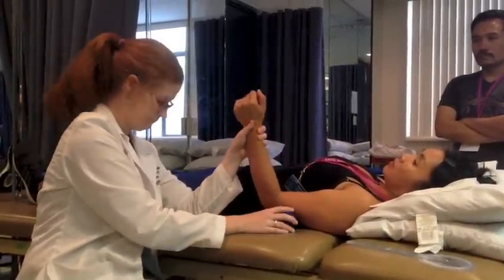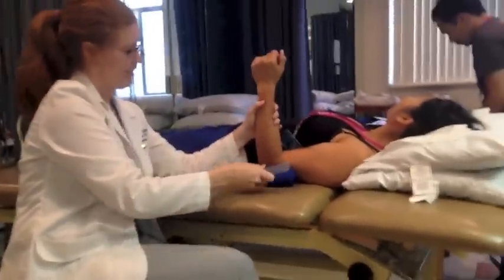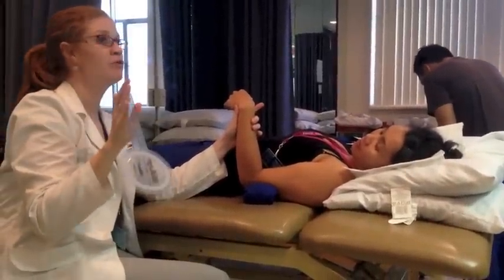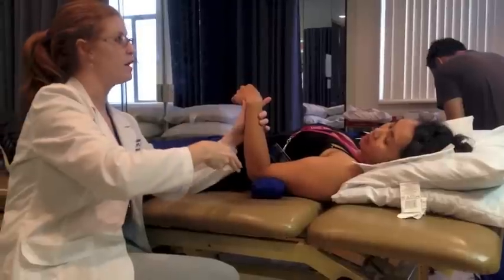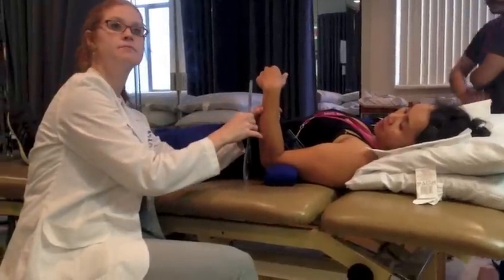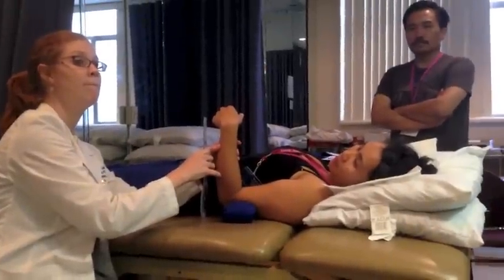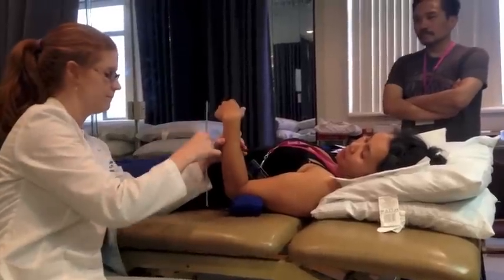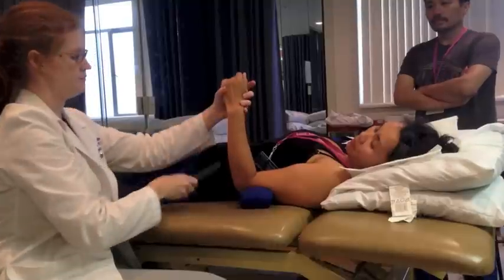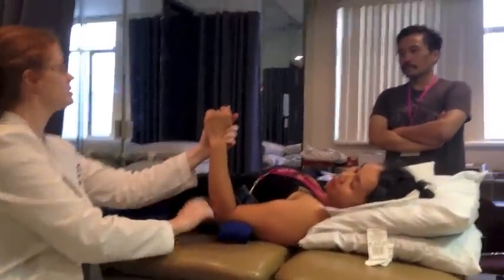Did we just push their stomach? The fulcrum, stationary arm, and moving arm for medial-lateral — same thing for internal rotation. The fulcrum is the olecranon process. The stationary arm is perpendicular to the floor, so straight up. The moving arm aligns with the ulna using the olecranon process and ulnar styloid — because the pinky side is the ulnar side and the thumb side is the radial side.